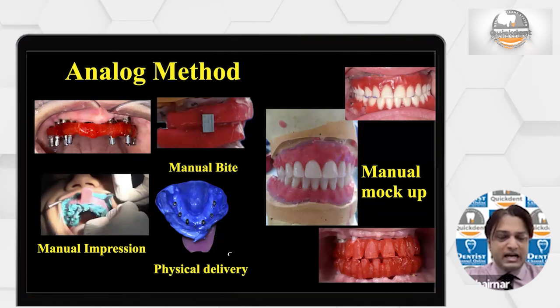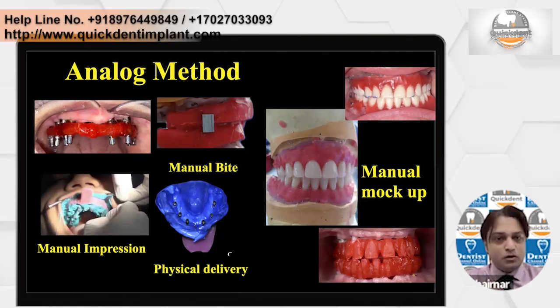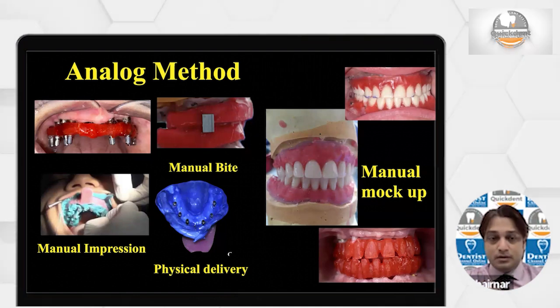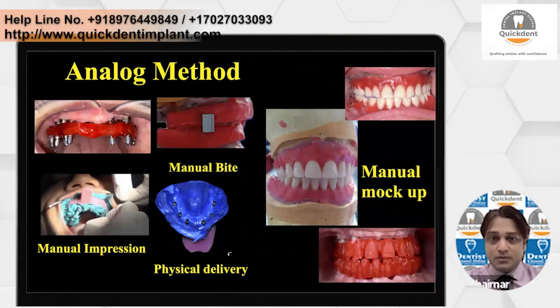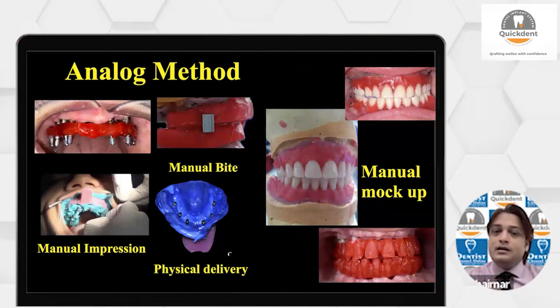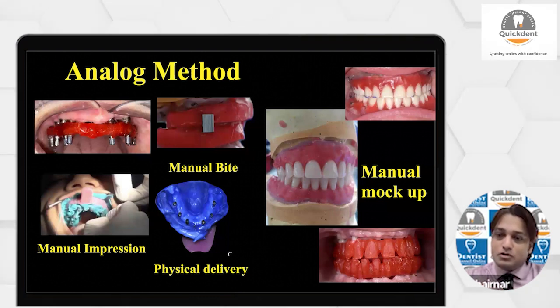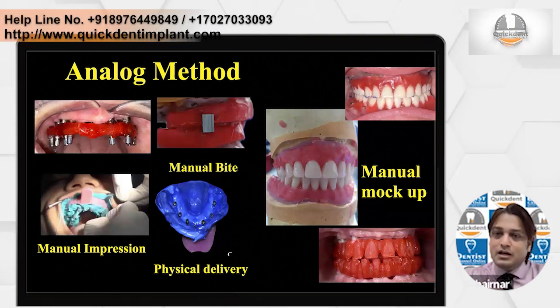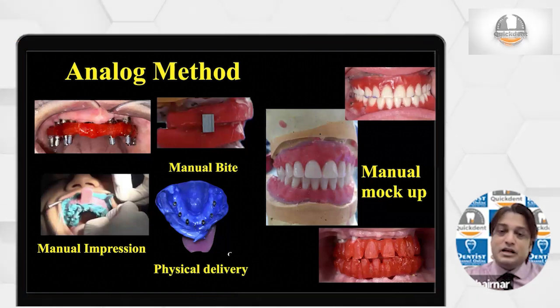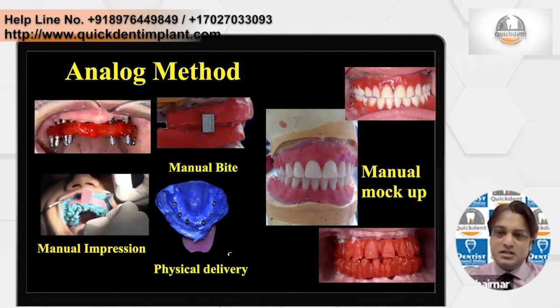So attach and then cut it and check verifications and have jig verifications, whether it's open or not, again re-verify. It takes time. So manual impression is the most important concern with the analog method. The second thing was the manual bite. You have to take the bite and you have to take the impression, and the physical delivery used to happen to the laboratory. So a lot of time used to get invested. The lab person has not come, and then you're waiting for the lab person, and you have to finish the case in 5 days, and he will come in the evening. So you have a lot of dependencies there.